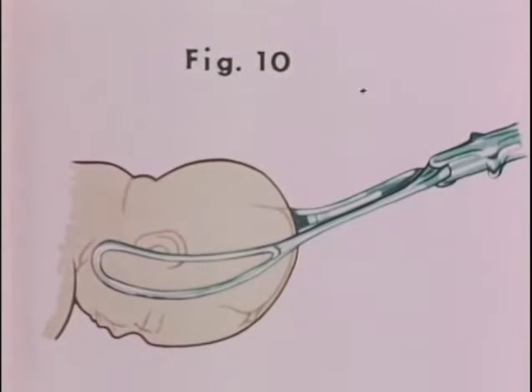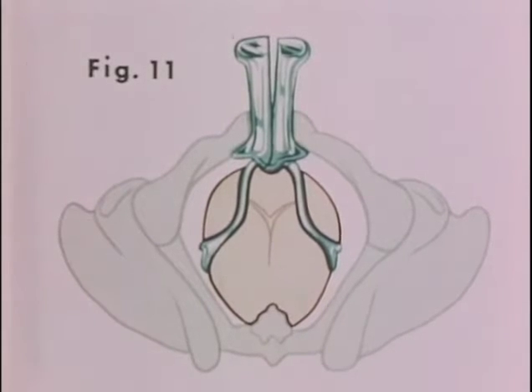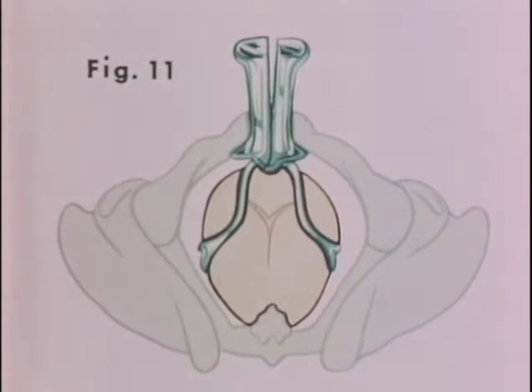In carrying out these checks, one should have, with the forceps applied, the posterior fontanelle a finger's breadth anterior to the plane of the shanks and equidistant from the sides of the blades.